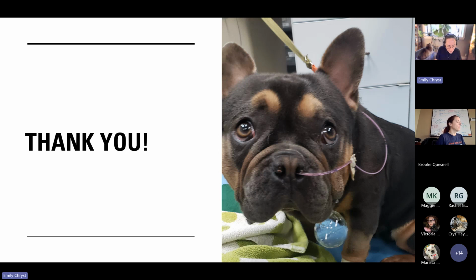No. The way in which it's going to track that over time is with the respiratory rate. You'll have your preset respiratory rate and your actual measured respiratory rate. And when those are different, your patient's triggering a breath. But it's not going to track it over time or timestamp it. If they're doing something funny and it's triggering a breath, but you're not quite sure what's going on, you can always hit that record button in order to capture it. But really, it's going to be the difference between the measured respiratory rate and the preset respiratory rate. It's going to be sort of your marker of that.